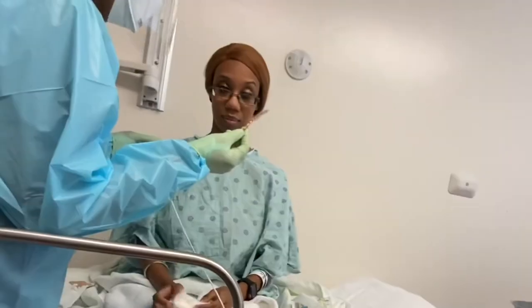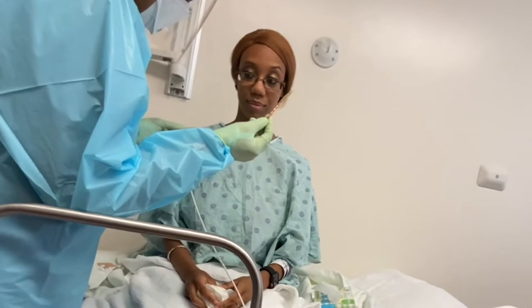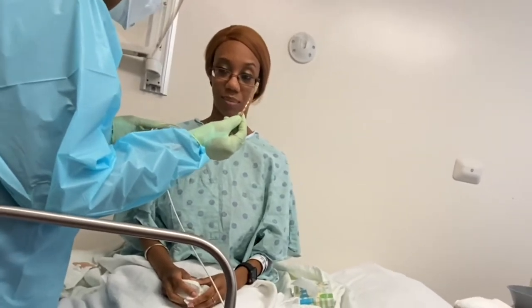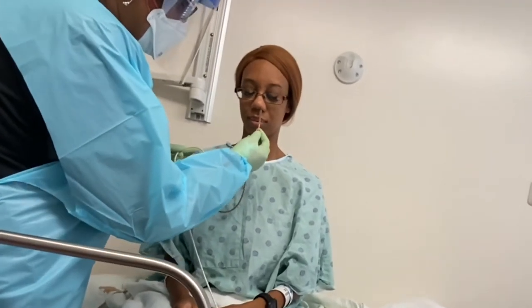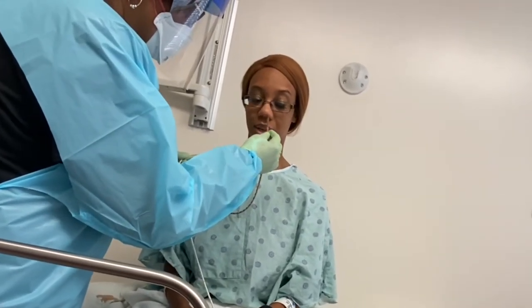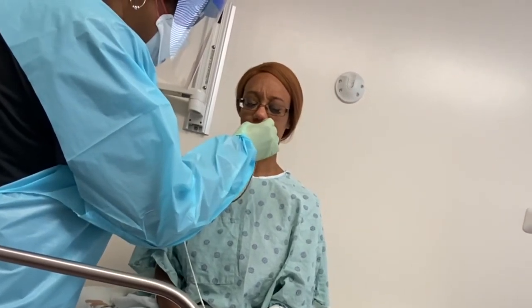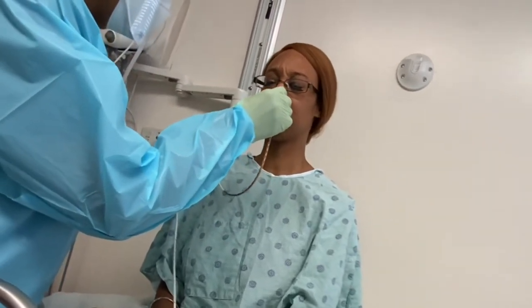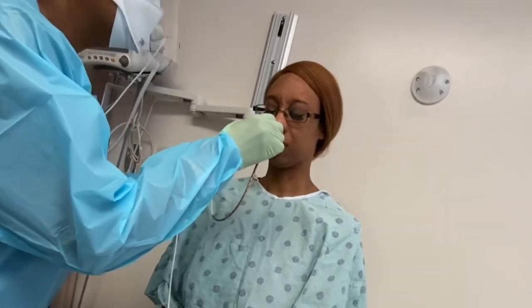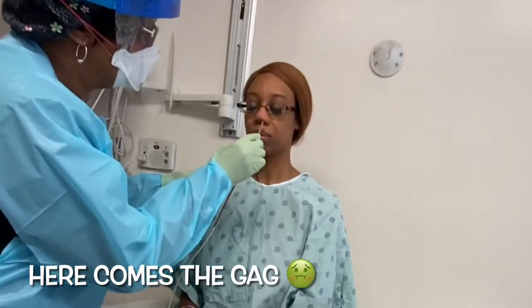Your eyes get ready to come up, and then you kind of look back. I'm going to just have you swallow, okay? My throat feels really dry. Okay. She's used to it. You can do it. Ow. Swallow the big part. Just take a deep breath. Swallow. Head down. Swallow. Good. And swallow. Head down. And swallow.